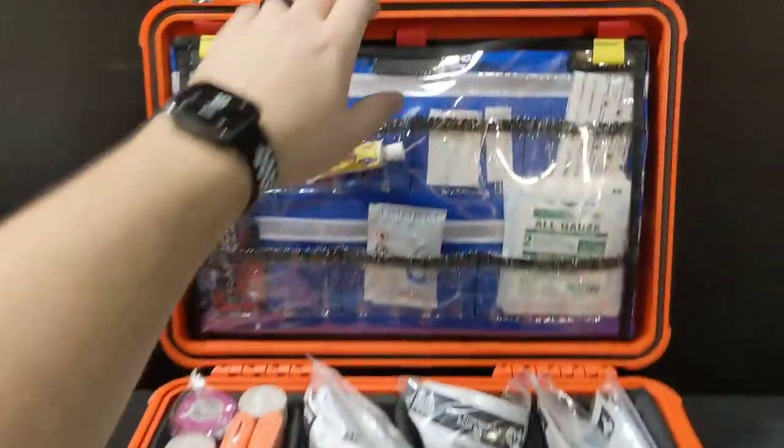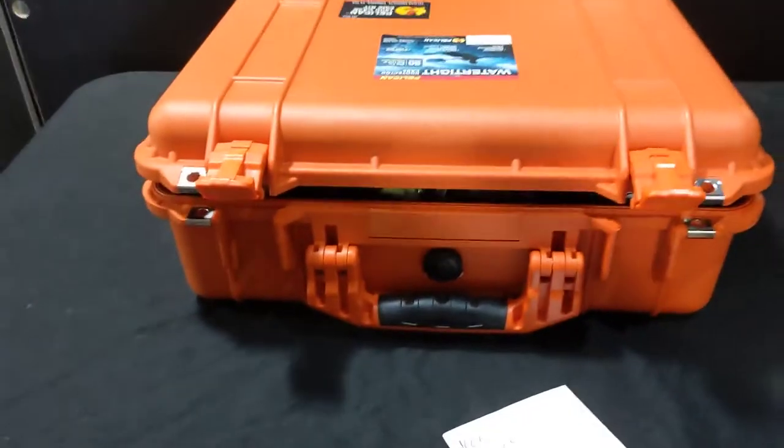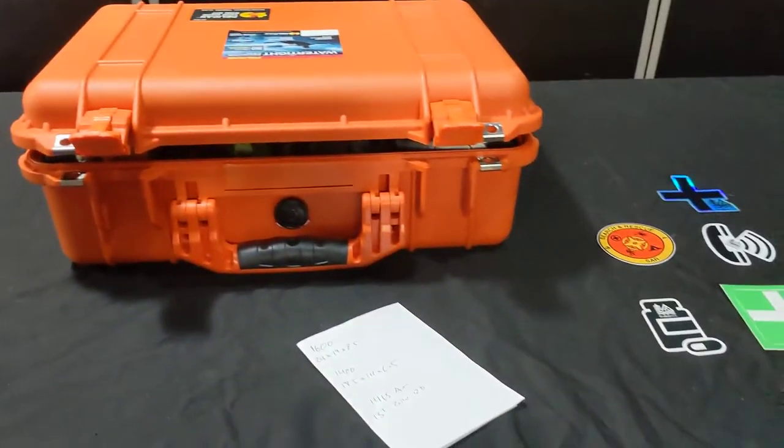This is the Pelican EMS 1500, now available at wildmadkits.ca.